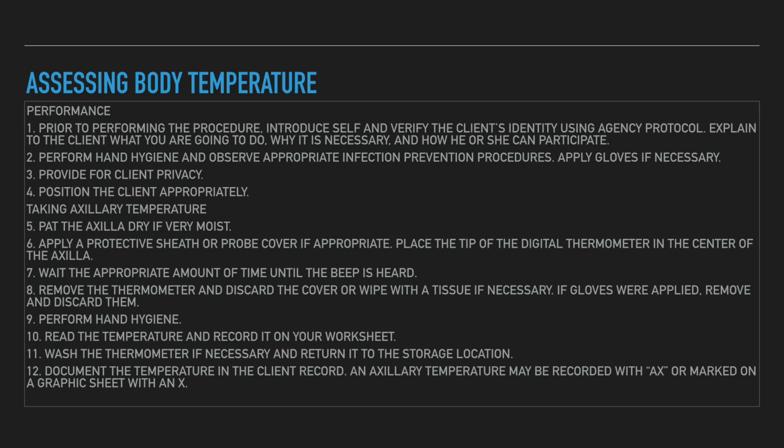Then, place the thermometer on the appropriate side. Apply a protective sheath or probe cover if needed. Lubricate a rectal thermometer. Wait the appropriate amount of time: 2 to 3 minutes for an oral or rectal temperature using a glass thermometer, 6 to 9 minutes for an axillary temperature with a glass thermometer. Electronic and tympanic thermometers will indicate that the reading is complete through a light or tone. Check package instructions for length of time to wait prior to reading chemical dot or tape thermometers.